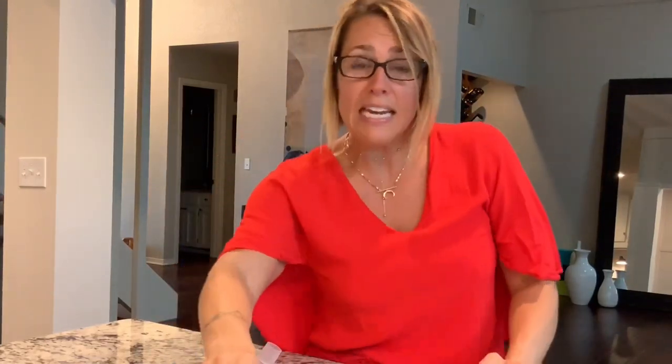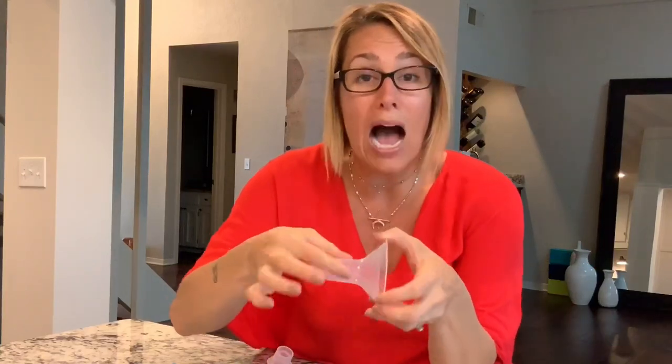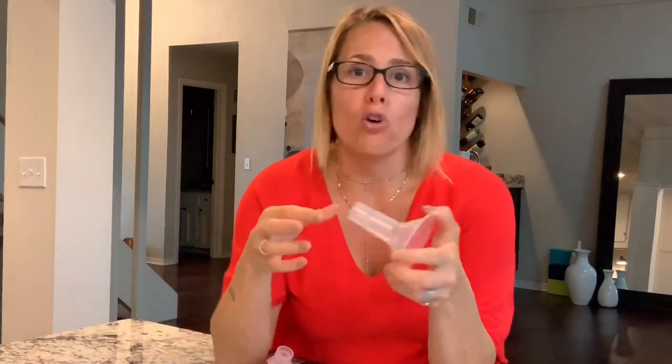During breastfeeding, you don't see it, but it fills up their mouth. So we need the pump flange to allow your nipple to get as long as it needs and as wide as it needs in order to properly stimulate you, keep your nipples healthy and intact, and express the right amount of milk without pain. They get longer, they get wider.